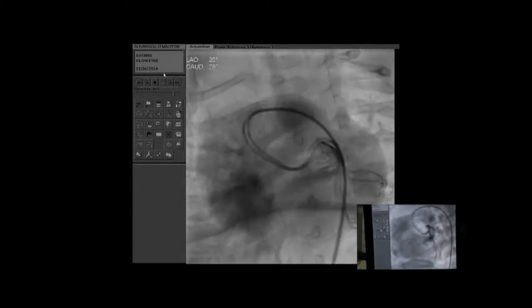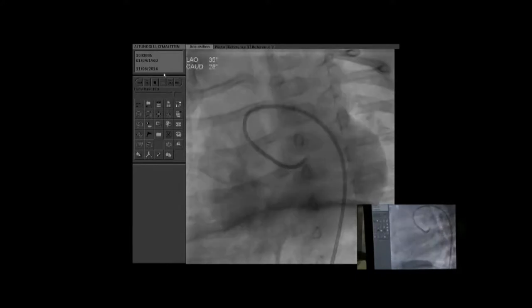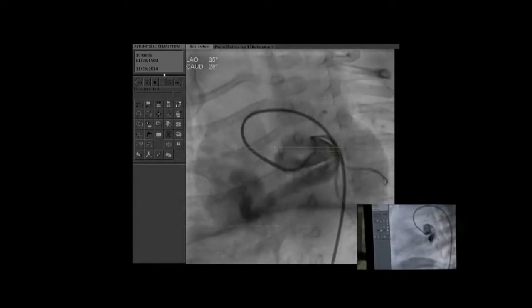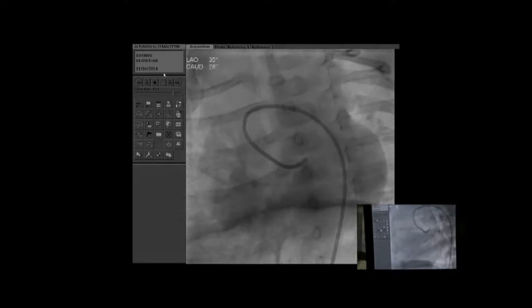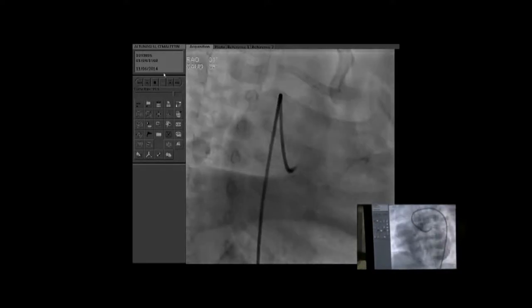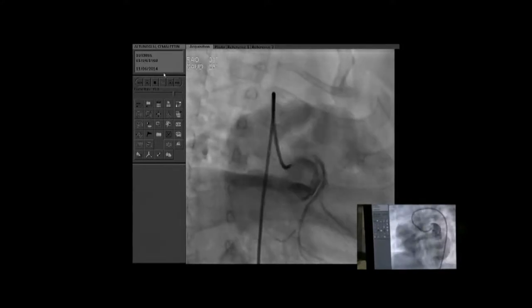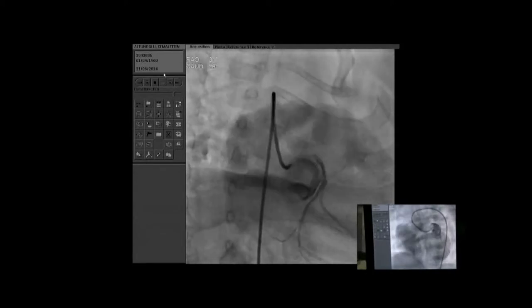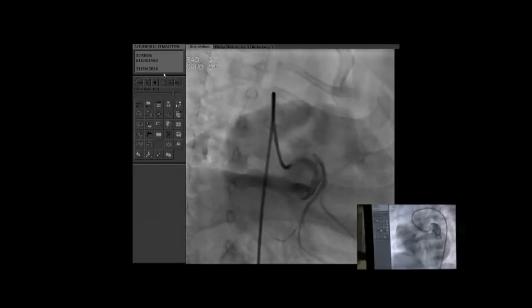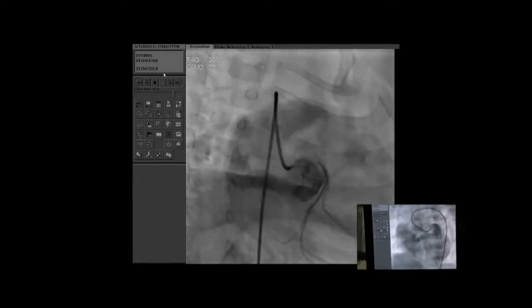If you look at about 1 o'clock on that projection, there's a ghost. That's the big fistula vessel, and the left coronary is up there. This is an RAO 30 view, which shows the circumflex and then the fistula going back towards the right atrium. There is quite a good 3 or 4 mm right atrial opening.